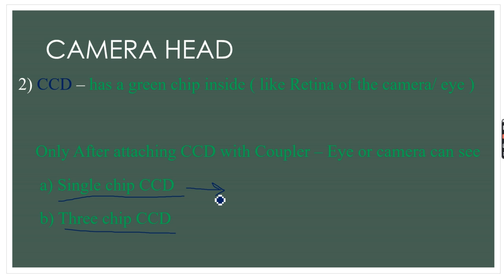And I agree, when the single chip camera was the only camera available, it was used everywhere for laparoscopic cholecystectomy, for laparoscopic appendectomy, and other minimal access surgeries.